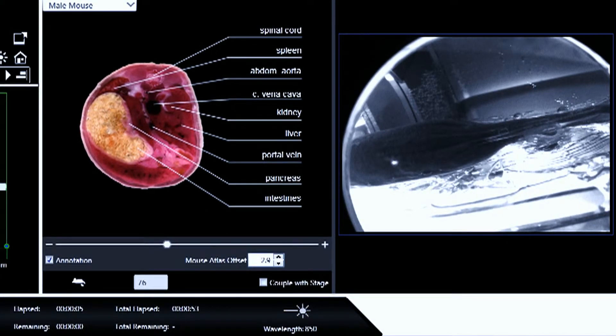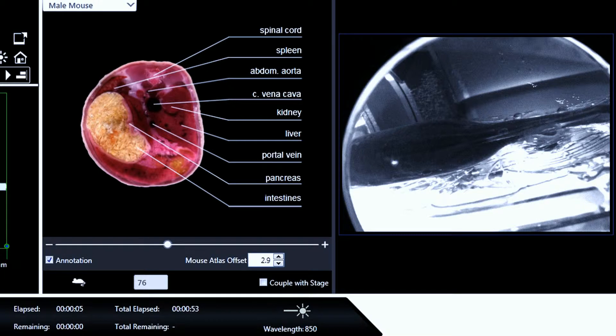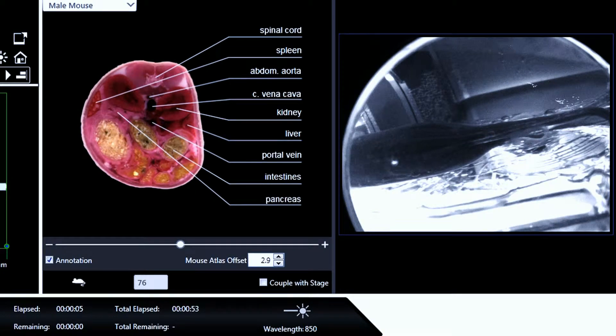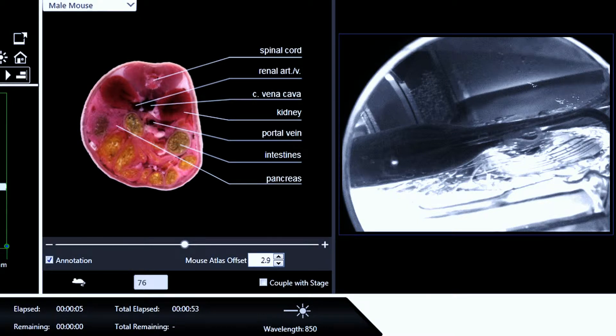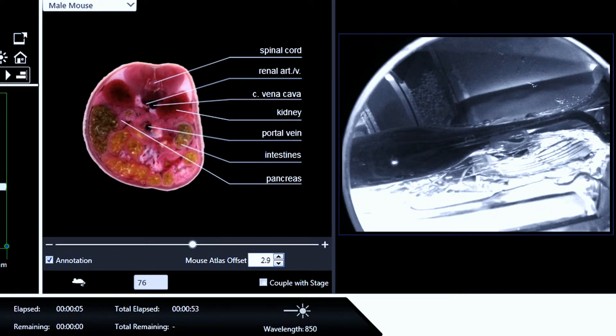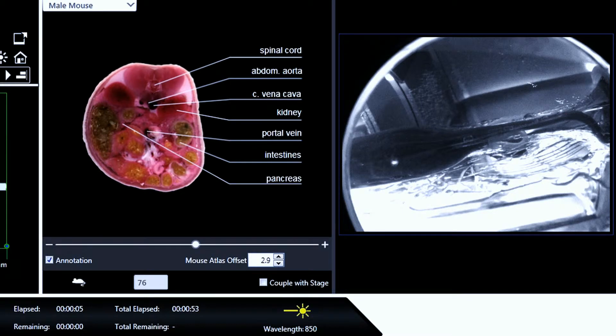During image acquisition, an in-chamber CCD camera allows for visual control of the animal. A mouse atlas featuring more than 100 annotated sections of male and female mouse anatomy serves as reference and is synchronized with the movement of the translational stage.